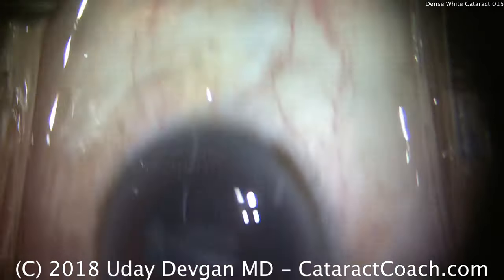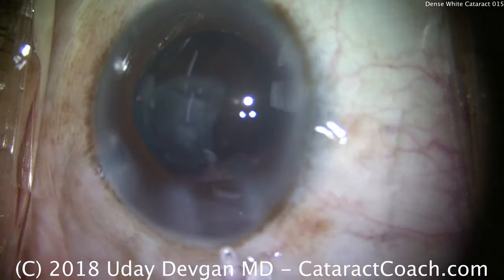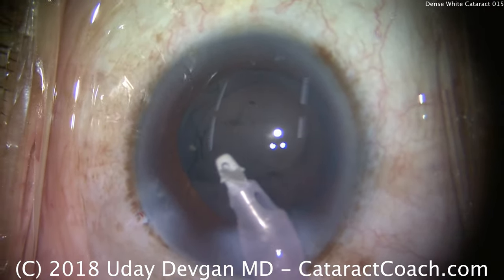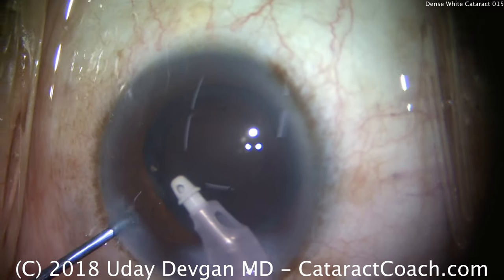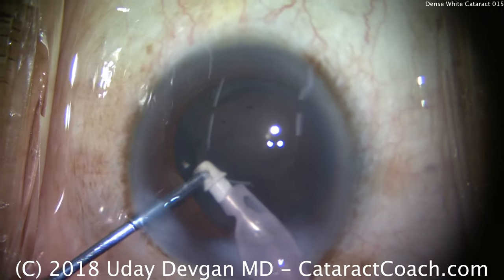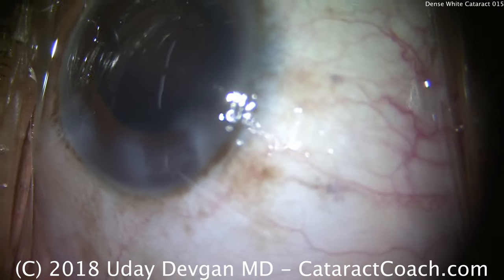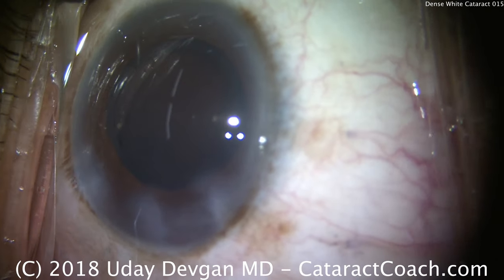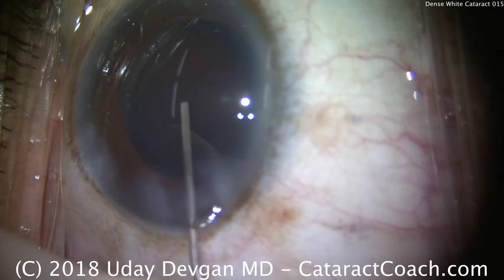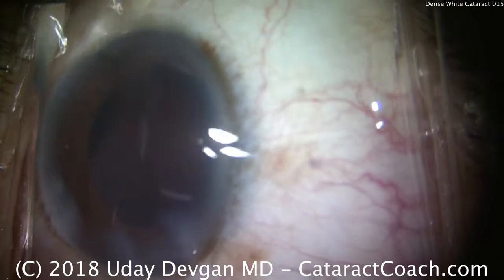So we'll switch over to the IA probe. A little bit of patient movement here — I think the patient's surprised that she can finally see some light. There's that epinuclear shell — we can just take it down with the IA probe. A tiny little nuclear chip, we got rid of that too. If it gets stuck at the tip, you can just use the second instrument or chopper to push it into the port, just like that. You'll note there's not a lot of cortex here. The red reflex is a little bit poor in this patient — she has underlying diabetic disease, a very dark pigmented fundus, as well as prior PRP, panretinal photocoagulation for the retinopathy.